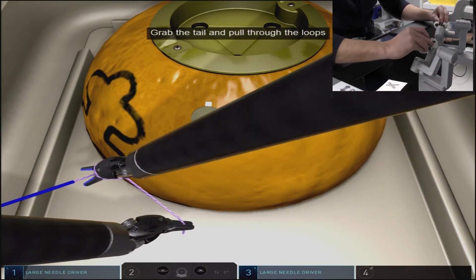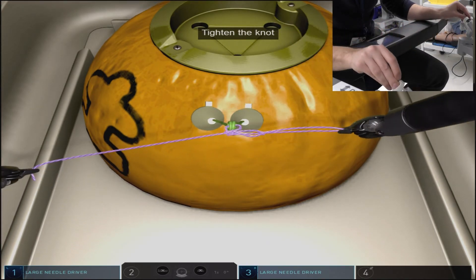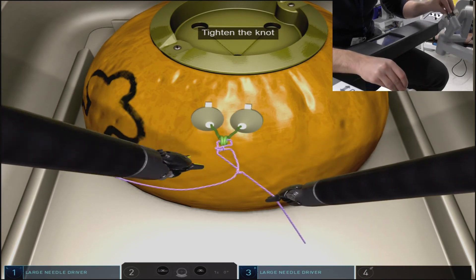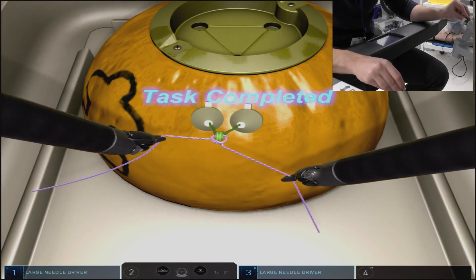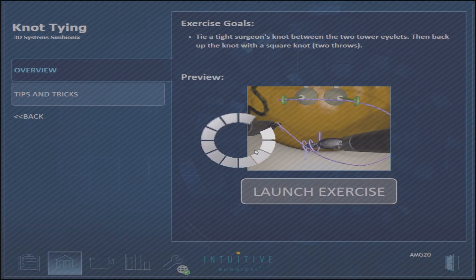Complete the third and final tie in the same fashion with alternating hands. Avoiding instrument collisions, instruments out of view, and excessive force are essential for scoring well in this exercise.